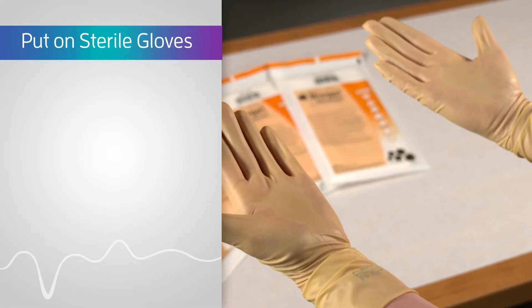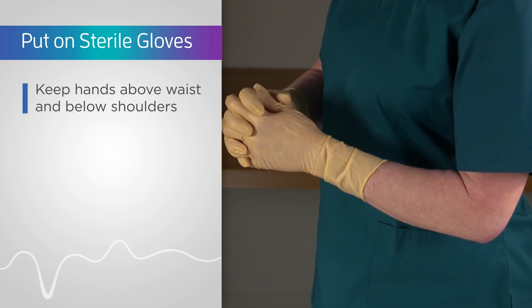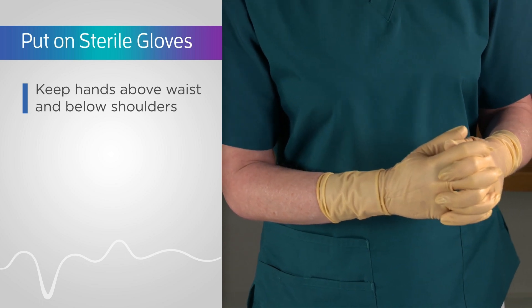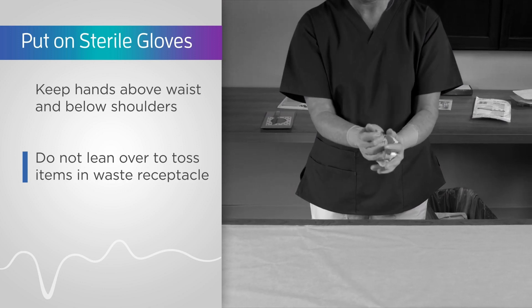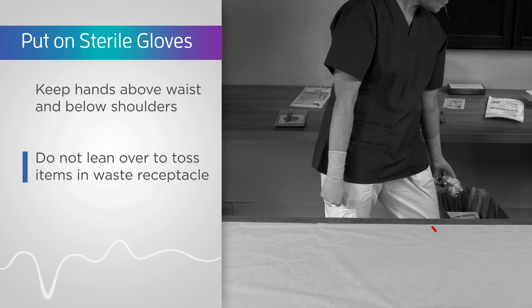Put on your sterile gloves. Be sure to keep the gloved hands above your waist and below your shoulders at all times, maintaining a safe distance away from your body to avoid touching your clothing. Don't lean over to toss items in the waste receptacle, as this is a frequent cause of breaking sterile technique.